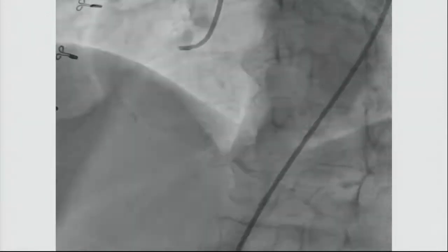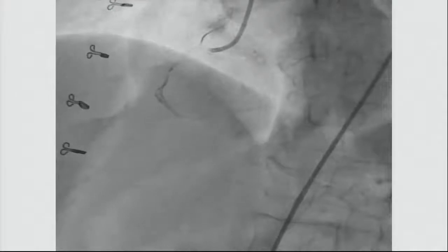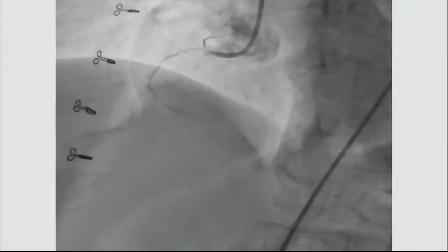Basically, she has a left main trifurcating with a long segment disease in ramus, LAD as well as the LCX, and she has a CTO of the right coronary artery. And we started with the right coronary artery considering that she had an old inferior wall MI with ejection fraction of 45%. So can you see the guiding shot, the RCA? Yes, we can see the shot.